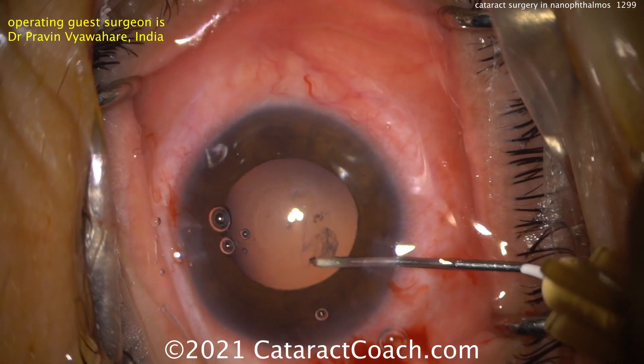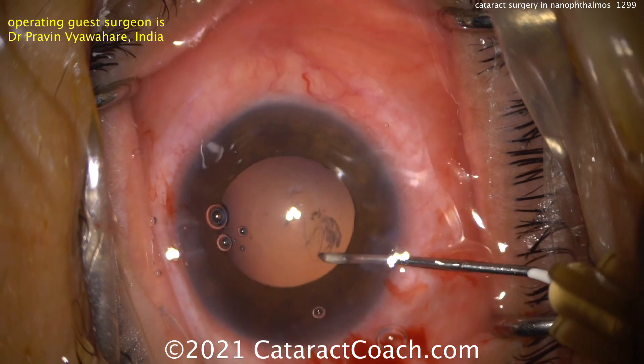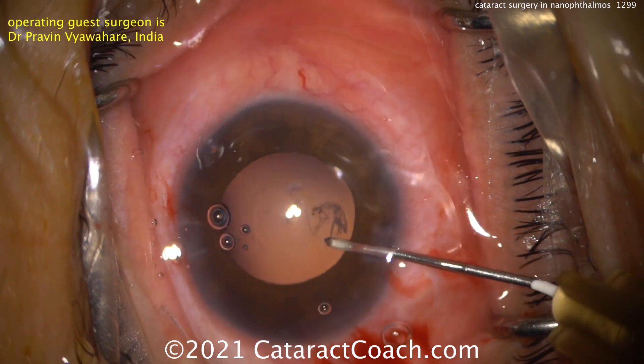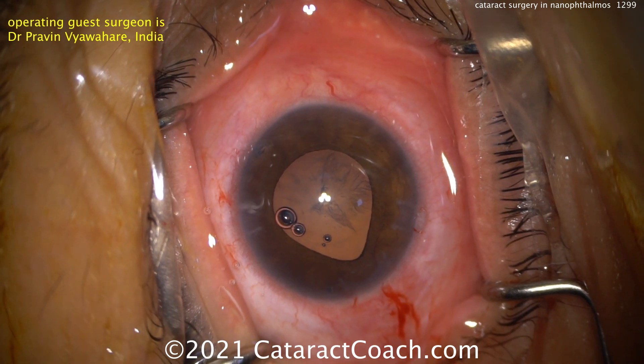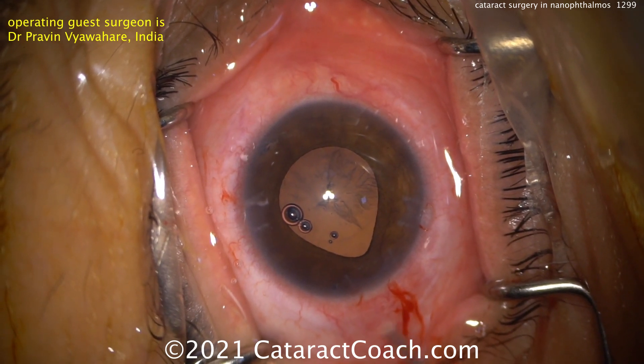Using the paracentesis allows a lot more precision and control. You can also use 23 or 25 gauge forceps through a paracentesis, and again you want to keep the AC formed and as deep as you can. Look at the iris prolapse already — it's going to be tough.